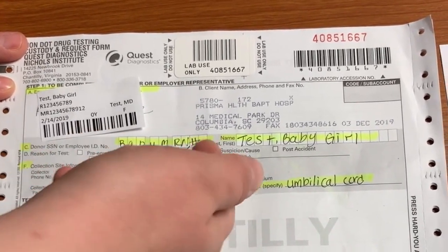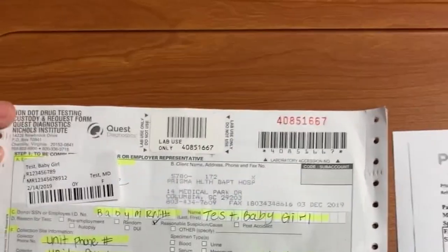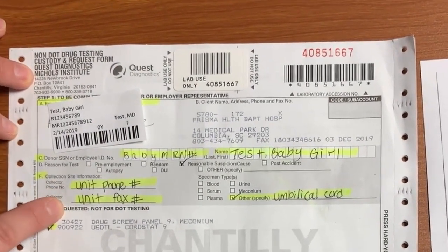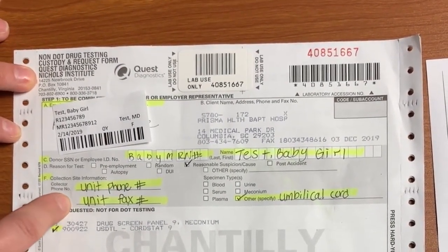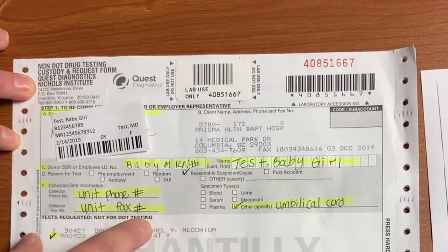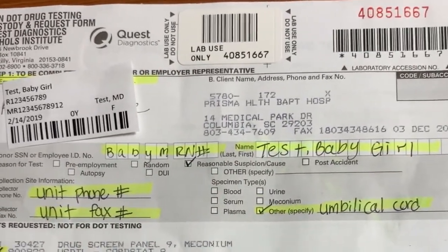Then you're going to fill out section C, and it's going to be baby's medical record number. And then you'll put in the baby's last name, baby, and whether it's a male or a female. F is your unit phone number and unit fax number, so that will vary by location. You'll check for reasonable suspicion or cause, and then select other and write in umbilical cord.